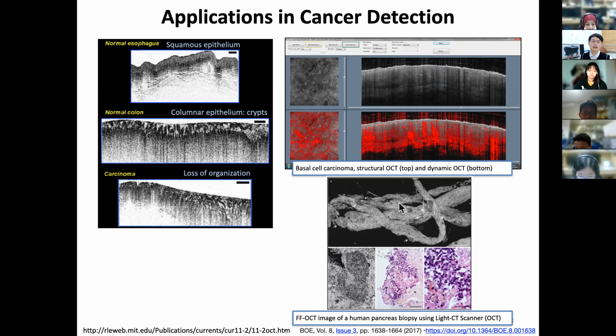So here comes an example of high resolution OCT being compared with an H&E stain, a pathology stain. So this is a human pancreatic cancer biopsy, and this circle, this dot actually shows a contrast. While OCT is just gray color imaging, when you look at them one by one with the H&E, you realize pancreatic cancer cells can be detected.